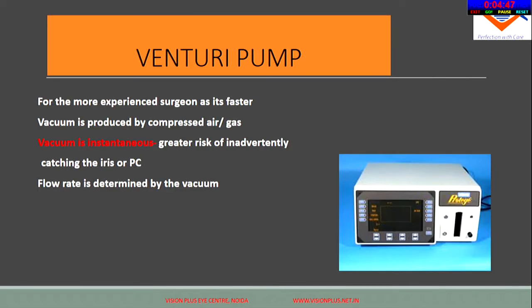So the Venturi pump is much faster. Here the vacuum, as we know, is produced by a compressed air or gas, and the vacuum is instantaneous. So though the surgery is faster, there's always a greater risk of inadvertently catching the iris or the PC.